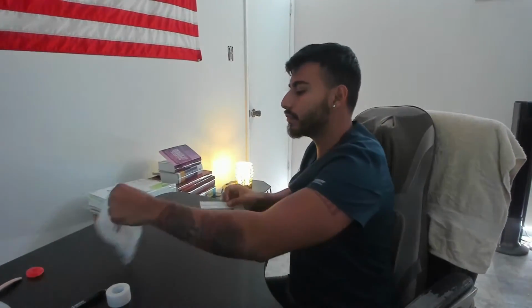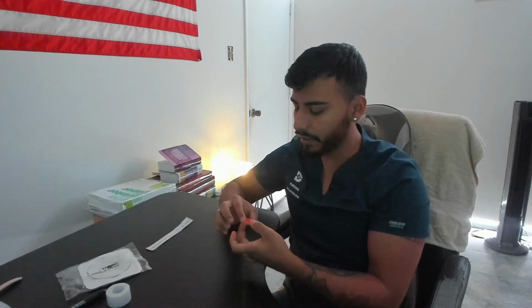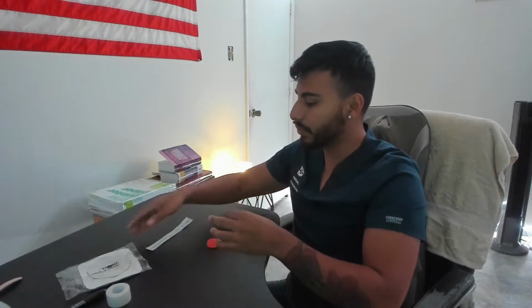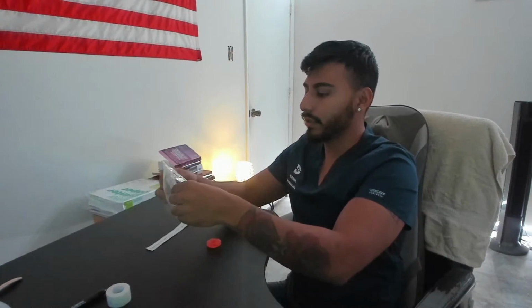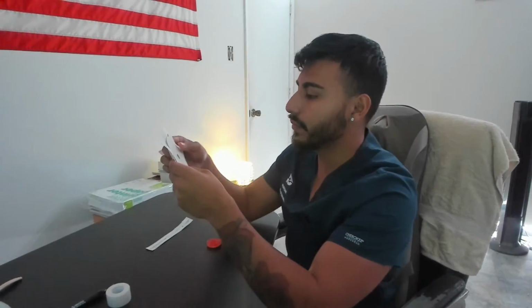I did my verification. My stoma is going to be my peach ring, because I was looking for my stoma, but I couldn't find it. I'm sorry about that. But peach ring. I measured my peach ring and everything, and so I grabbed my wafer. With measuring my peach ring, it would be 45 millimeters.